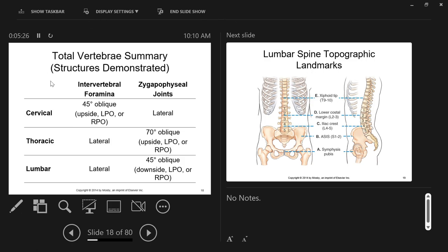Two very important structures we're looking for in the spine on different projections are intervertebral foramina and zygapophysial joints. You'll want to know in what position either of these things is shown for any given area of the spine. Notice that the cervical spine is just different than the lumbar and thoracic. The lumbar and thoracic both show intervertebral foramina in the lateral projection, whereas the cervical spine shows those structures in a 45-degree oblique projection.